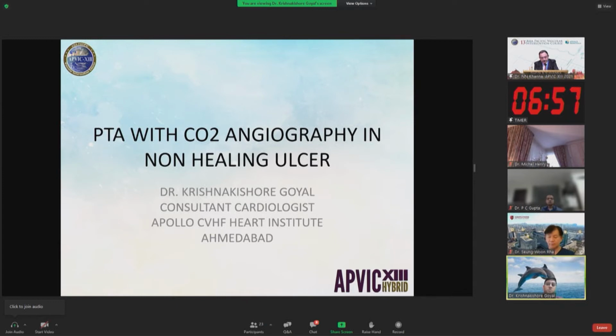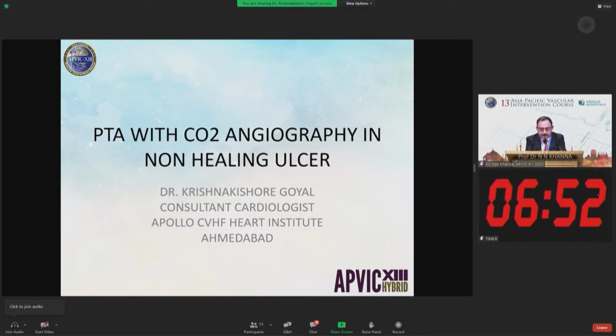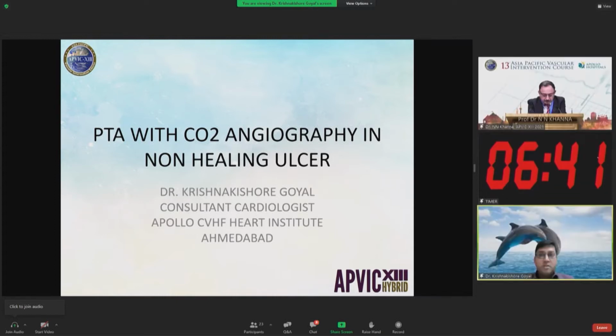I think absolutely correctly told by you that in renal patients we need to use this technology. I used it less frequently and landed up in problems, and after that started using this technology, and I found it useful, rather than people telling that it's not easily visible, the visual clarity is not there. So later on, we have started using CO2 angiography quite frequently. So this case is not very interesting, but let's discuss something about CO2 angiography in this case.